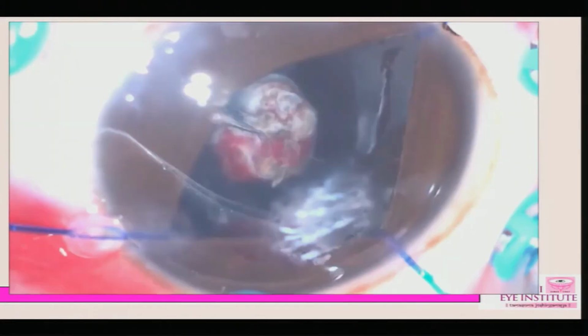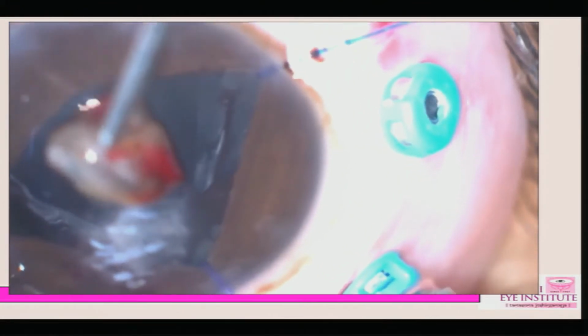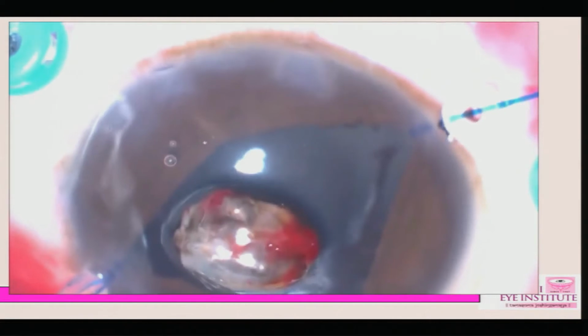Membrane dissection. And then when I got to know that it was no longer a unimanual surgery, I did not hesitate to do a bimanual surgery in this case. Because as you see there, the retina was incarcerated in the choroid, and then I tried to bring back this foreign body, making a scleral tunnel. And then I could visualize that it was nearly a stone piece measuring around 5 into 6 millimeter.